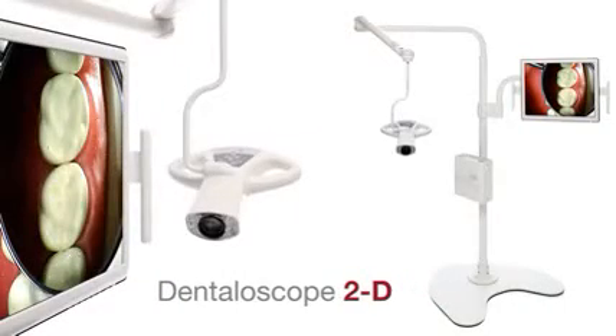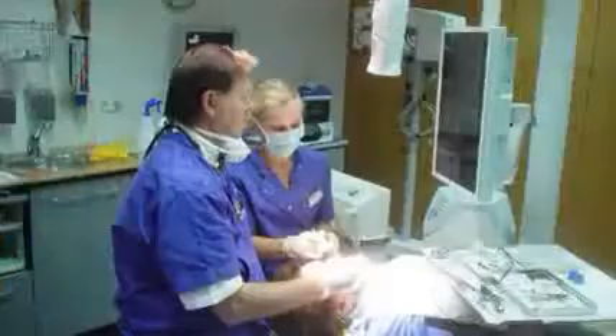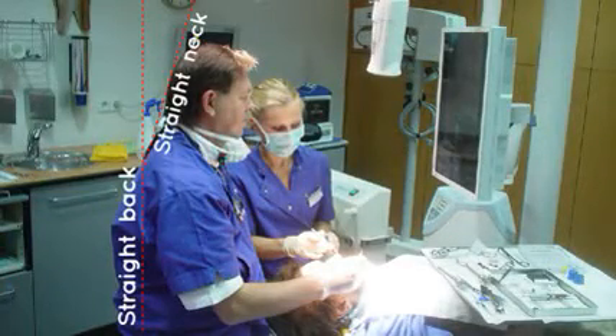You've got to sit upright, you've got to be able to sit correctly to have health. The real key to seating health for a dentist is to be able to sit upright, have a magnification system like the Dentaloscope 2D, and be able to work off of the screen where you're not looking down, hurting your neck and your shoulders.